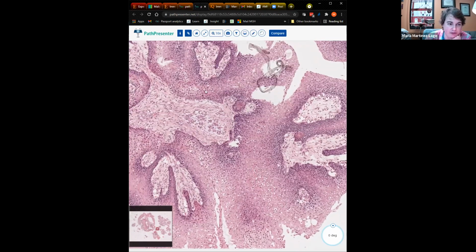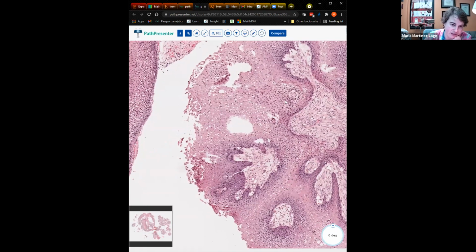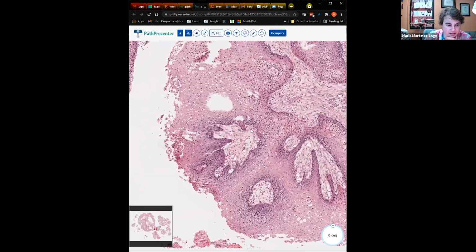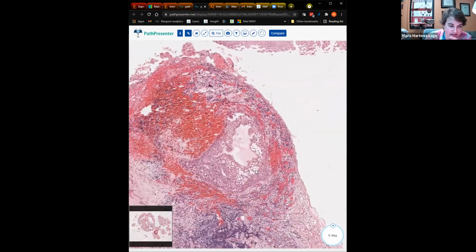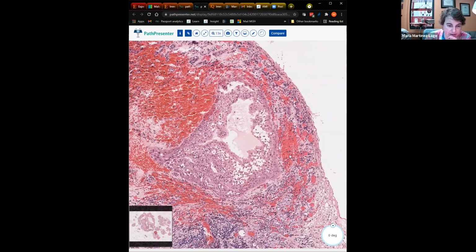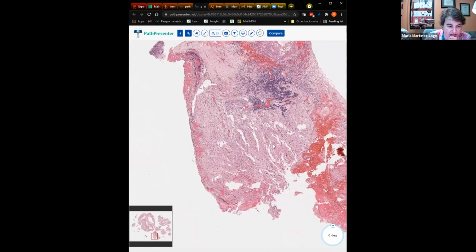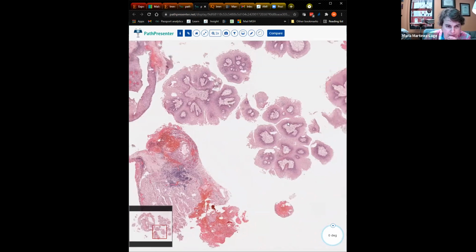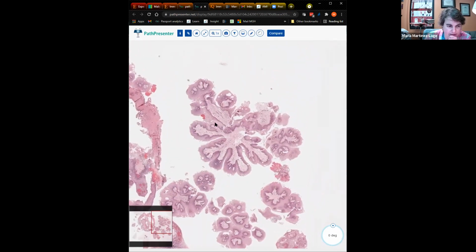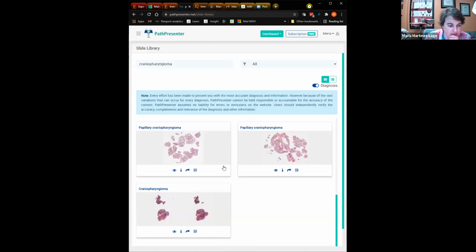So if you want to confirm that what you're looking at is papillary craniopharyngioma, you can do BRAF mutation staining, and you will see labeling of the epithelium itself pretty clearly. This is a good thing for patients with this entity because they can be treated with BRAF inhibitors if surgery and radiation have failed to control the tumor. Okay, that's pretty much all there is about craniopharyngiomas.